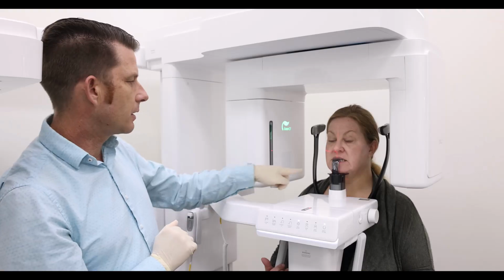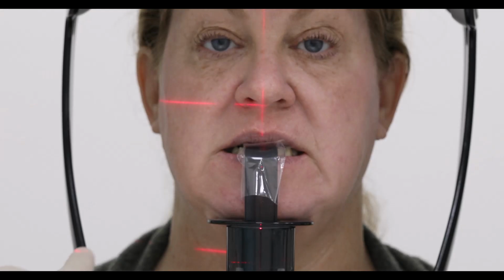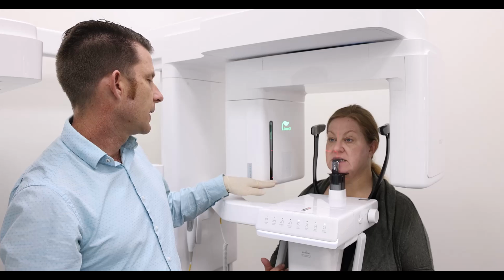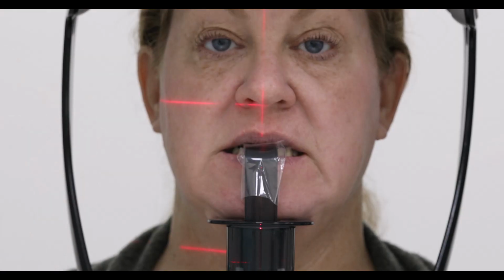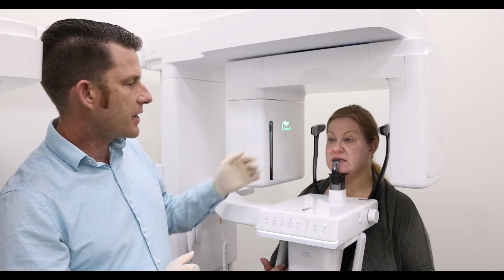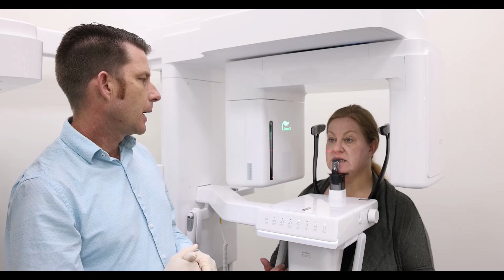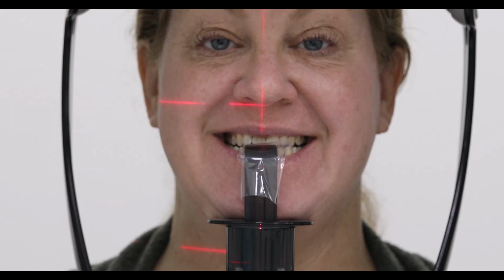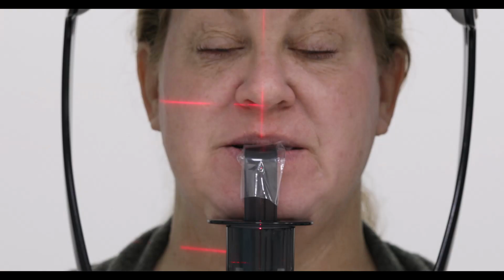You'll also notice the lower horizontal beam, which shines on the patient's neck. That is shining off the base of the X-ray tube, which denotes the rotation. This will give us a way to see if the overhead will be bumping their shoulders. I have my patient biting on the bite stick. I have my patient smile really big for me. I can see the occlusion is flat or parallel to the floor. You can relax your lips.